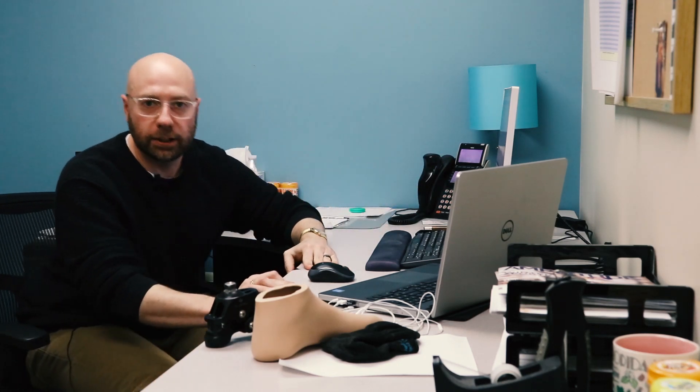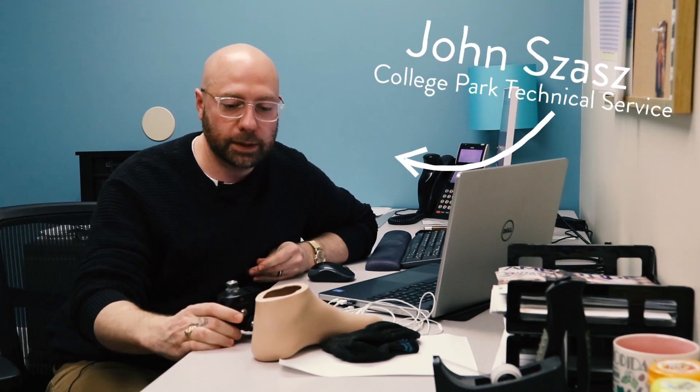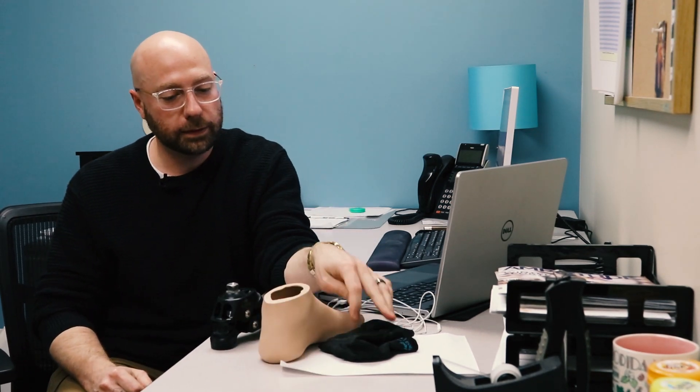Oh, hey guys, glad you're here. It's me, John, from the Technical Service Department here at College Park Industries. I wanted to talk to you about something. This truestep foot gets a bad rap for being hard to put in this foot shell here, and you know what? It's true, it is hard. I did this for a lot of years and built a lot of these feet and put a lot of them into this foot shell. But I figured out some ways to make it a little bit easier, and I want to share those with you. So what do you say we head out to the floor and I'll show you how to do it.